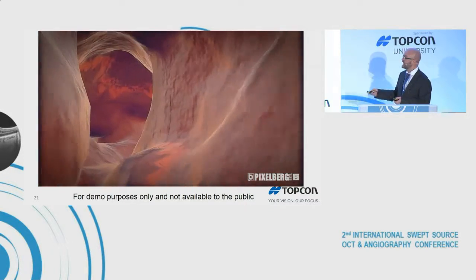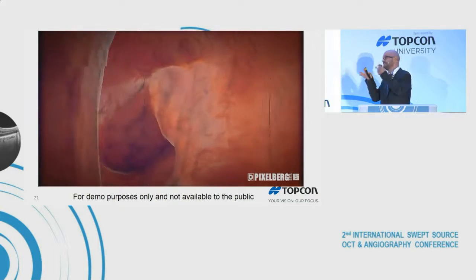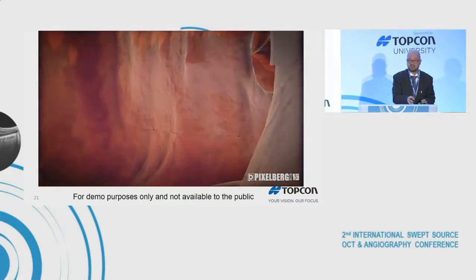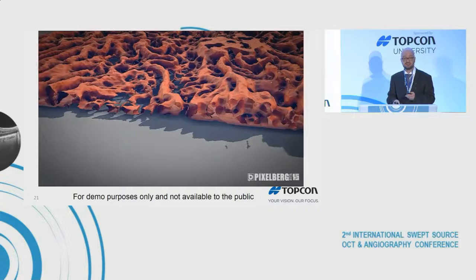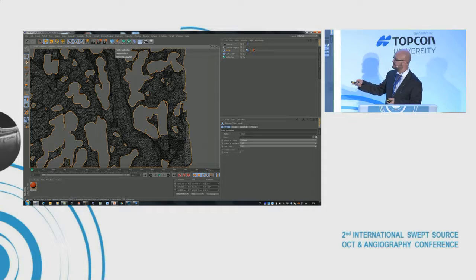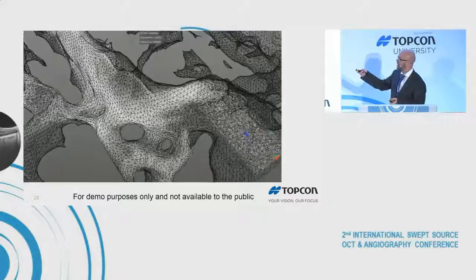But what I want to do is see if I can give these walls physical properties so that I can use fluid dynamic simulations inside of this segmentation, so that we in future can do volumetric measurements and see also if changes inside of the vessel diameter will cause changes in the fluid dynamics inside of the choroidal vasculature. So what I did was I segmented out an area of this vessel, and I created a Navier-Stokes-based fluid dynamic simulation inside of this vessel.